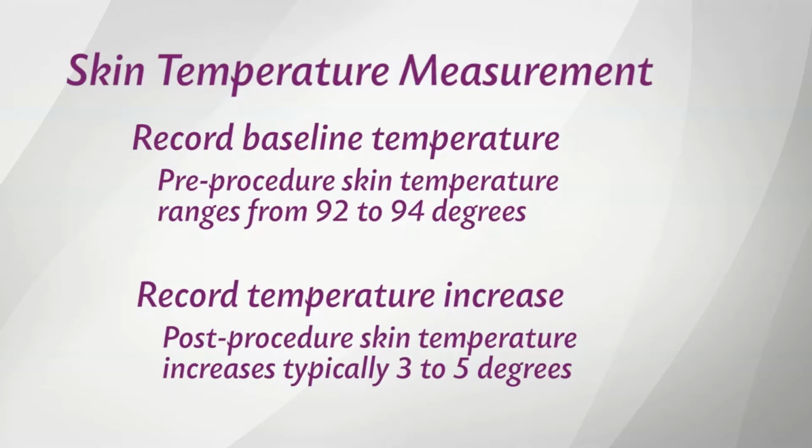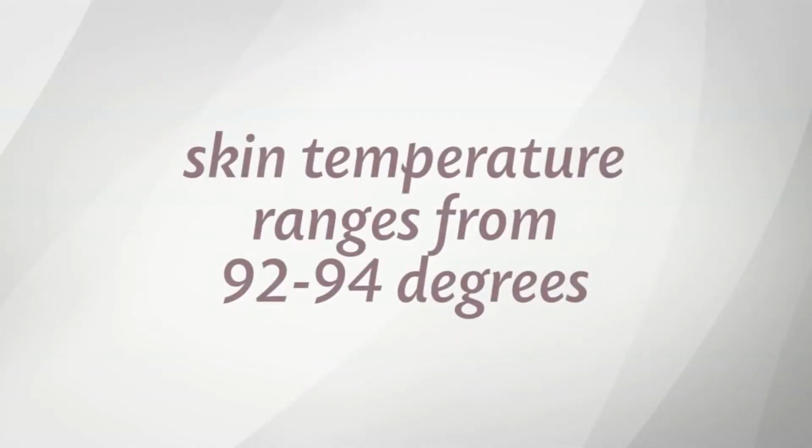Documentation of the baseline temperature must be carefully noted and recorded prior to initiation of the pre-medication procedure. Typical pre-procedural skin temperature ranges from 92 to 94 degrees.